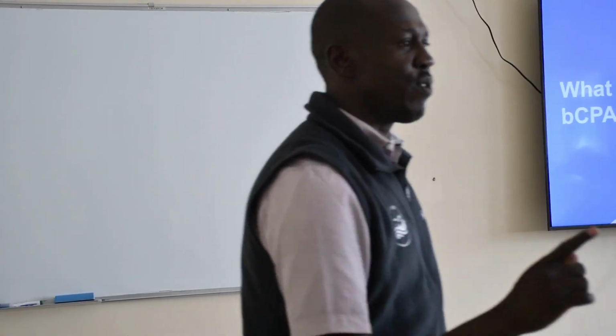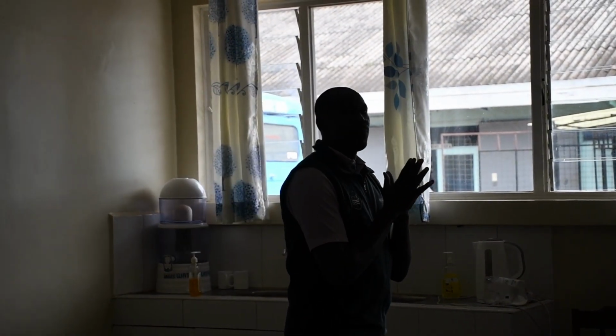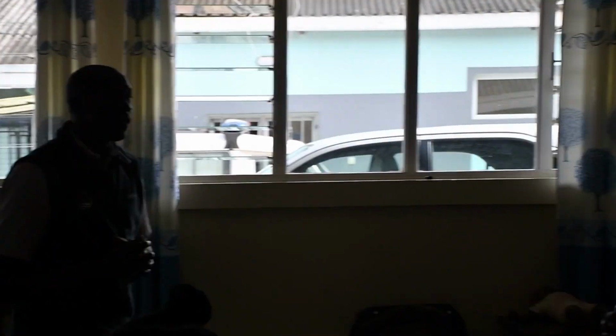You have used CPAP before, right? So what are the indications for putting a baby on CPAP? RDS. Yes. What is RDS? It's respiratory distress syndrome. Very good.